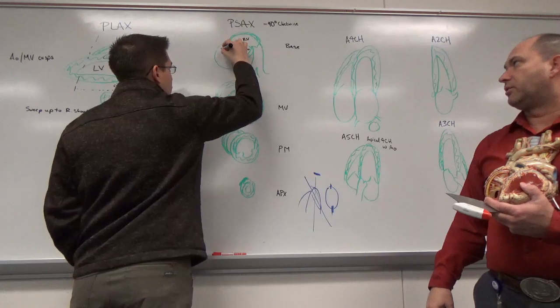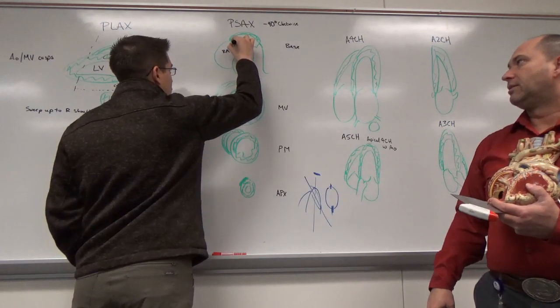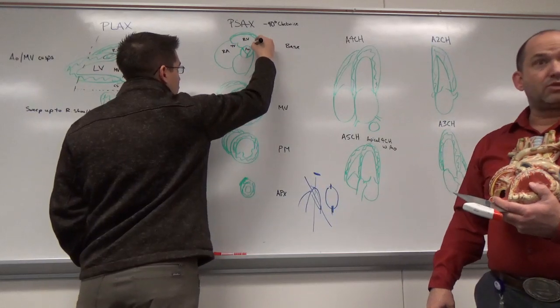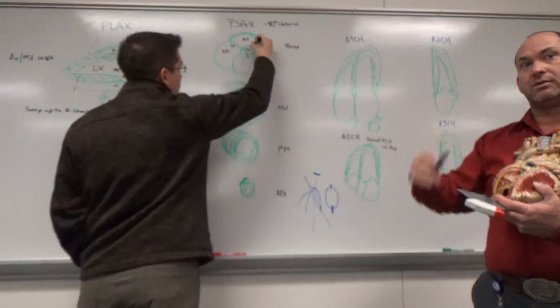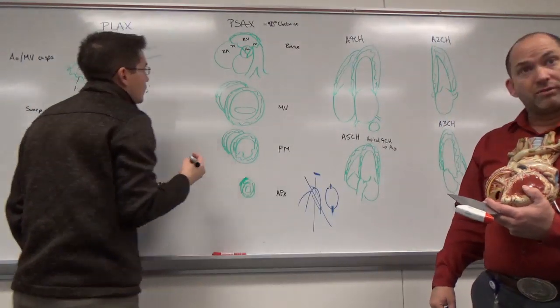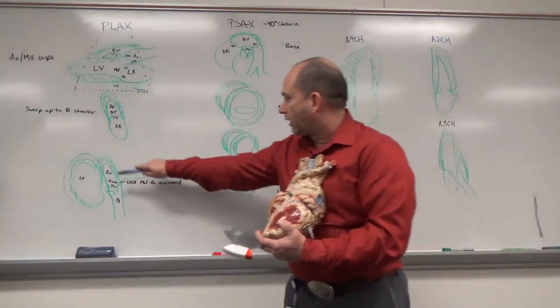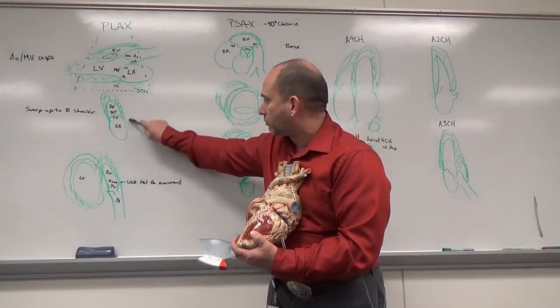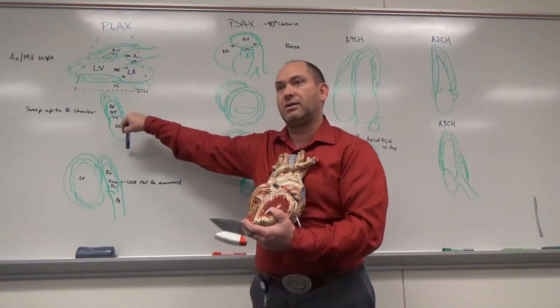Let's label the valve. So the one on the left is tricuspid valve. Okay, and this is how it should be oriented on the left side of your screen by ASE standards. And then pulmonary valve is the other side. So you can tell by the valves, these two views here, if I didn't have the left ventricle in here, these two look pretty similar in our views because we have a whole bunch of messy stuff going on down at the bottom.